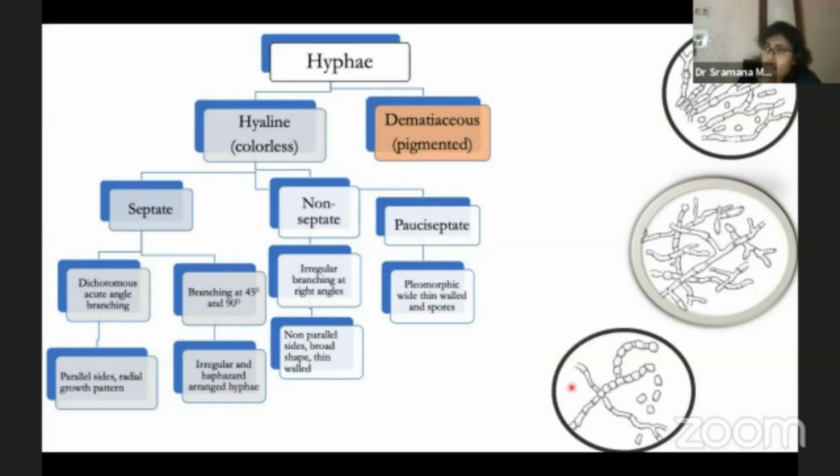Then there are the dermatophytes. These dermatophytes are also hyaline septate fungal hyphae, and they reproduce by arthroconidia. So that is also very typical. So that can be appreciated on the histopathology specimen.